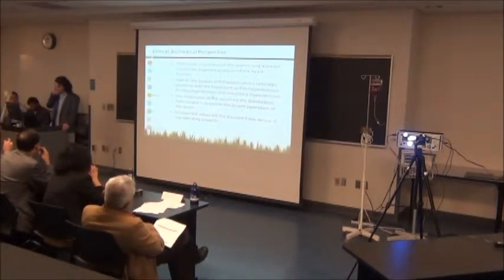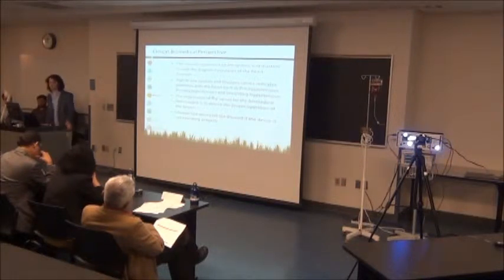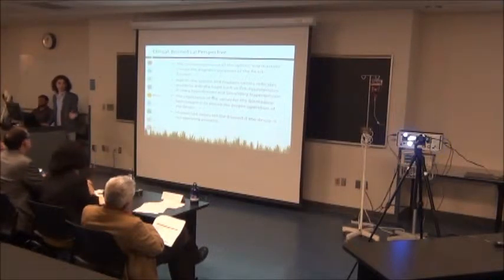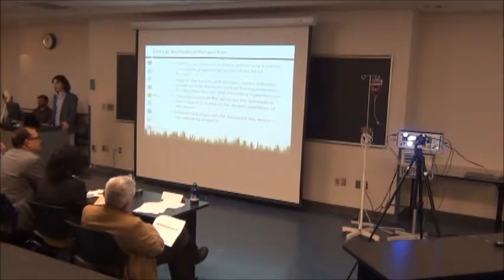The systole and diastole are also very important for the biomedical technologists. For example, the biomedical technologists will perform some troubleshooting based on these numbers. If a patient has no problems with his heart, and then suddenly the value of the systole or diastole jumps to 100, 140 or 160, then we will detect that something is wrong with the device, and we have to perform some troubleshooting.